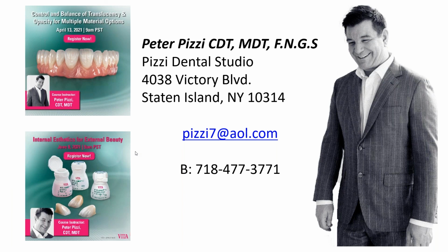Without being insulting to people who do them all the time, I kind of call it the McDonald's of a restoration. Everybody's doing them very similar, very staining, and I don't think they have as great of an effect. Where I have shifted to be more digital or more current is with the Mark II, or I call it the Evolve material. The Mark II is a milled feldspathic veneer, where I can mill out the veneer and either use it as a monolithic or micro layered on top. And it's much more aesthetic in my mind than lithium disilicates.